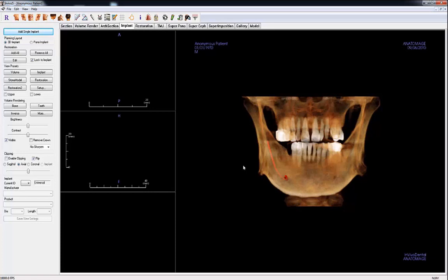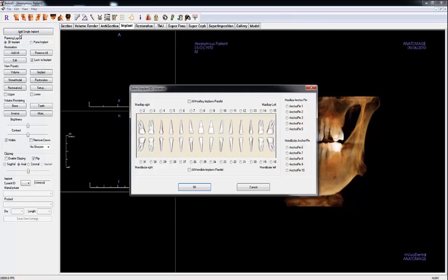The purpose of the Implant tab is to plan implant placement. There are two methods to place implants. The first method is to insert a single implant in the 3D implant view. Click Add Single Implant and choose the implant to insert.